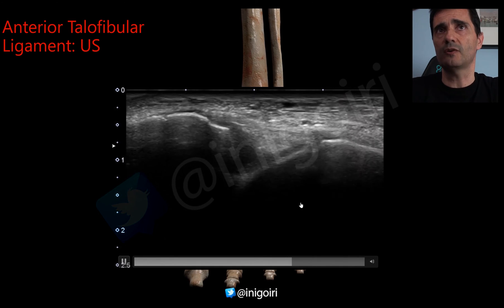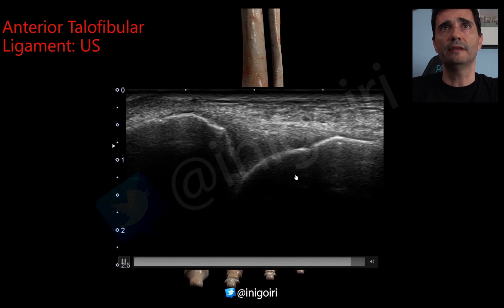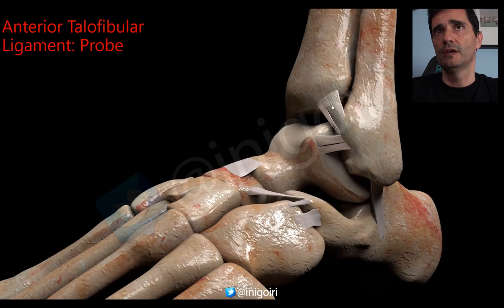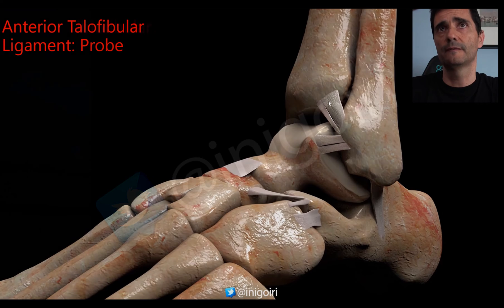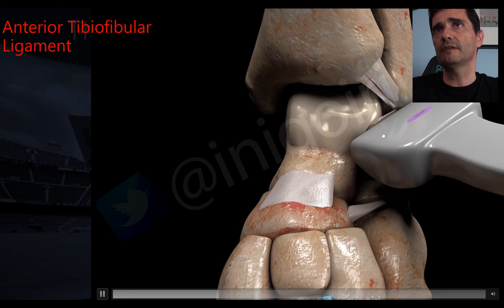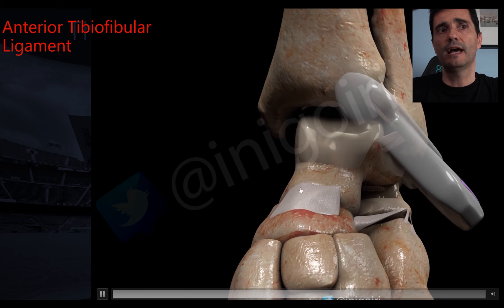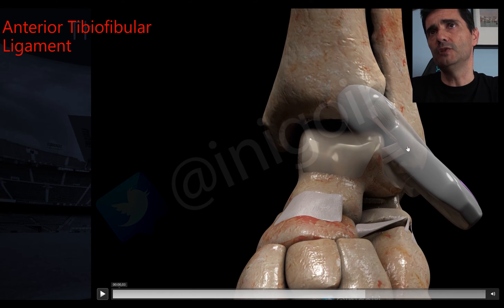Once we have checked the anterior talofibular ligament, we must check the second ligament: the anterior tibiofibular ligament. This is a component of the syndesmosis and stabilizes it. Injury to this ligament is called a high sprain of the ankle. To find it, we turn the probe 45 to 50 degrees upwards, positioning between the fibula and the tibia.